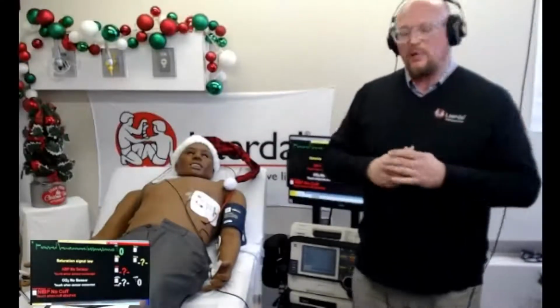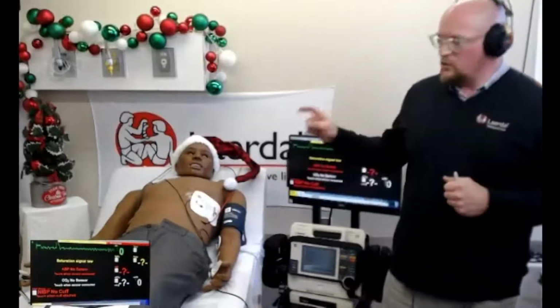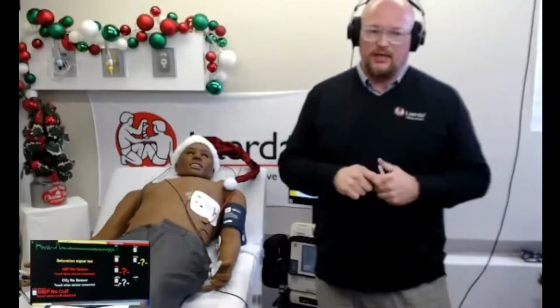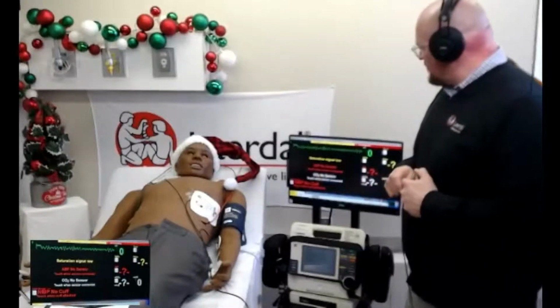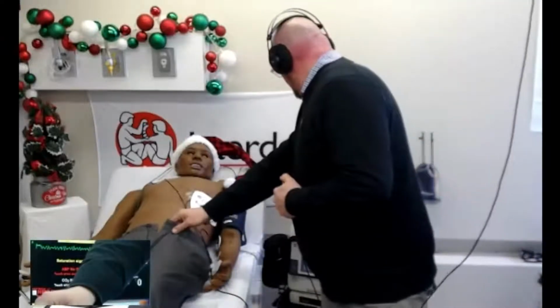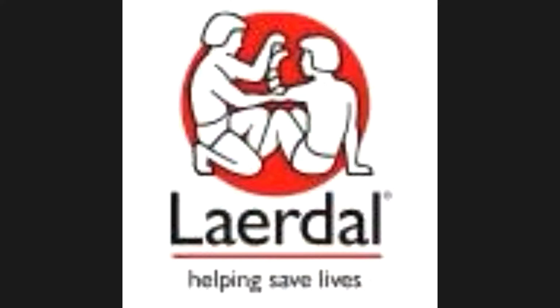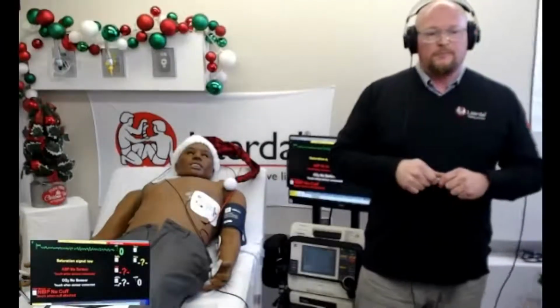Again, it's all about how these pads are connected and really using those silicone dressings on the SimMan 3G Plus. So that's there, he's shocked. Well, he's not good. He's still in a not very happy rhythm here. I can always just move.